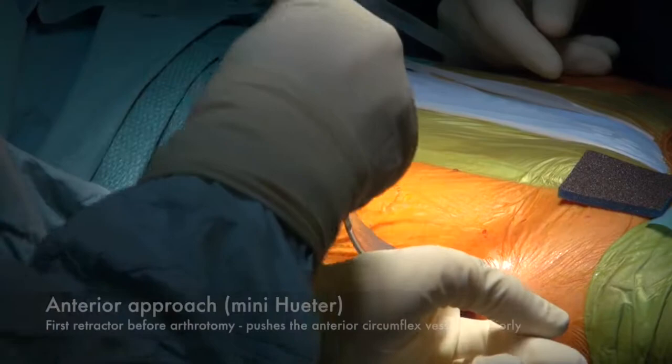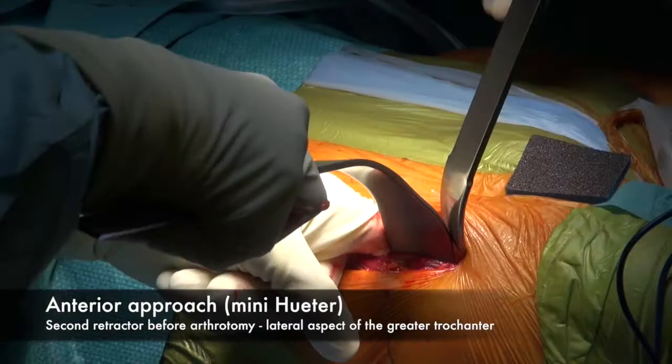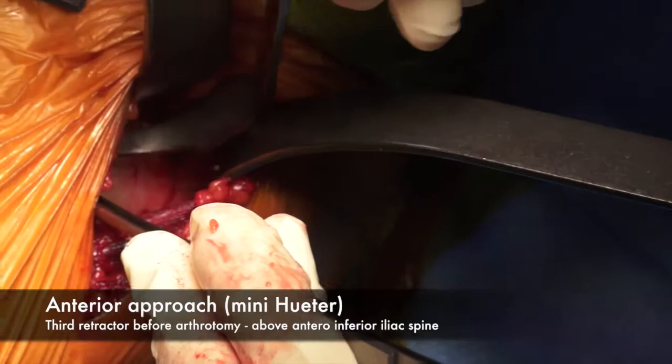First retractor before arthrotomy pushes the anterior circumflex vessels inferiorly. Second retractor before arthrotomy, lateral aspect of the greater trochanter. Third retractor before arthrotomy, above the anterior inferior iliac spine.